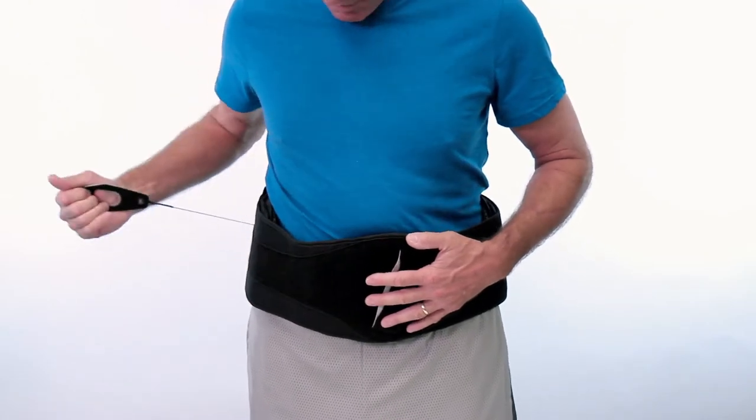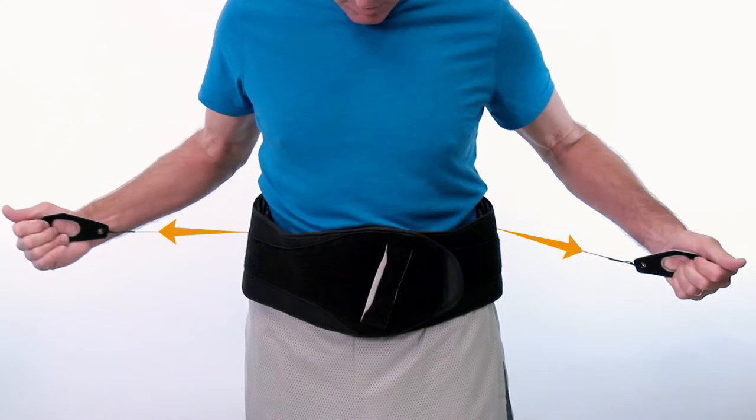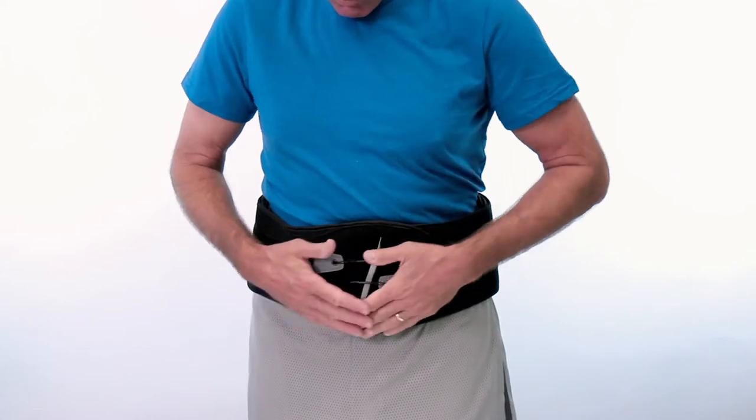Pull the finger pull tabs out and away from the body until the desired tension and support is achieved. Finally, secure the pull tabs onto the front of the brace.